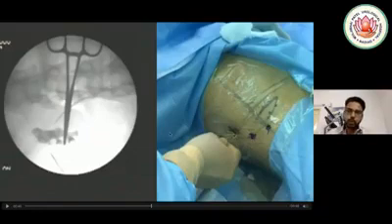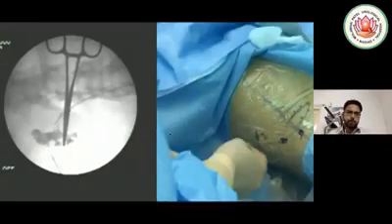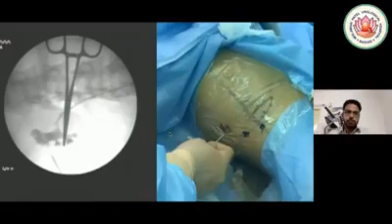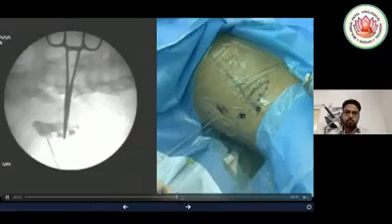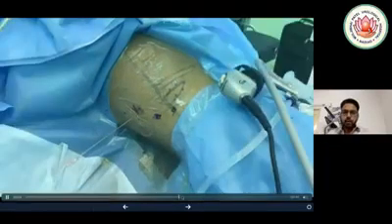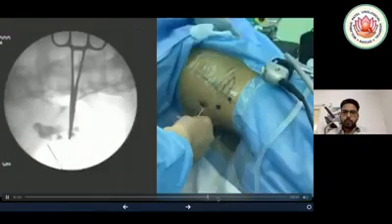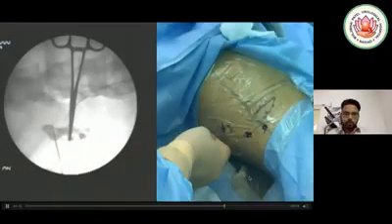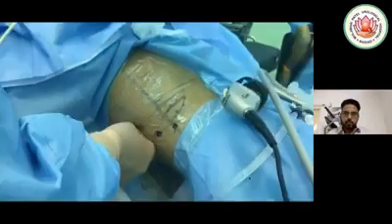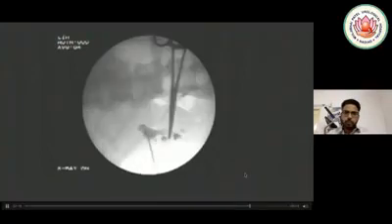I've gone supra 12th and I have started much medial to the posterior axillary line, at 0 degrees. Once the desired calyx is reached, we rotate the C-arm in the same way in craniocaudal direction, needle moving in the same direction as the X-ray tube. Therefore, it is anterior and the direction is readjusted to reach the calyx once again. After reaching the calyx, rotating the C-arm in craniocaudal direction, we can see there is not much relative movement between needle and the calyx. So this is a successful puncture we have done.